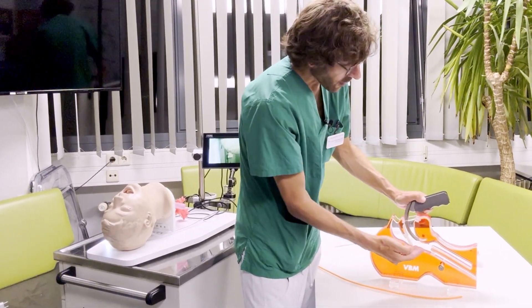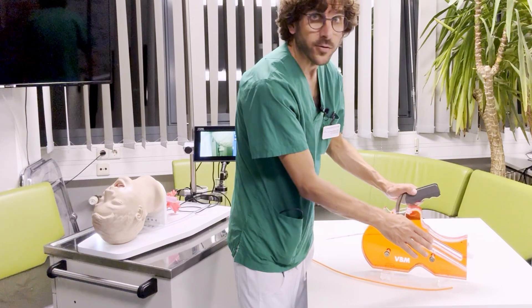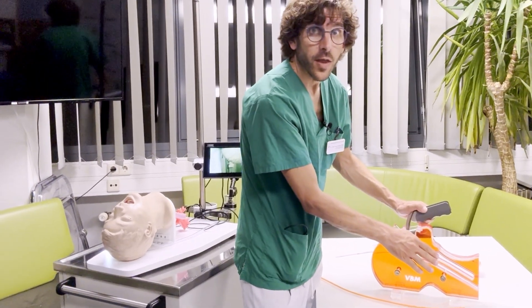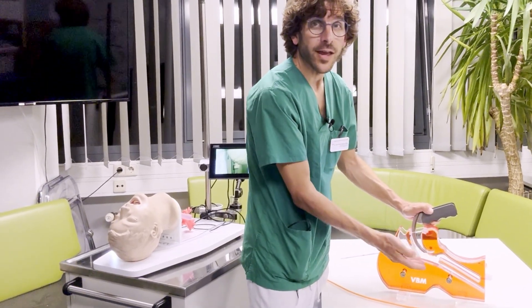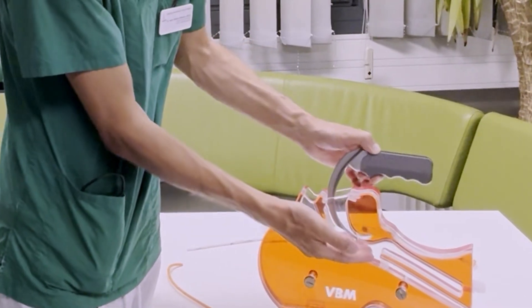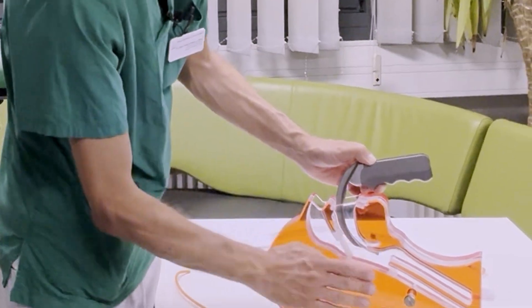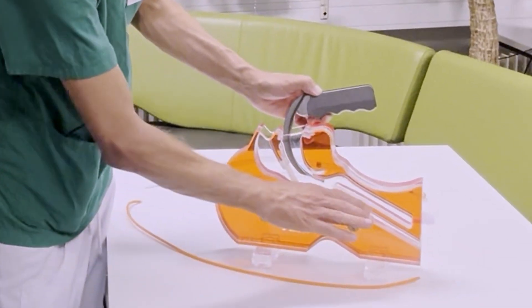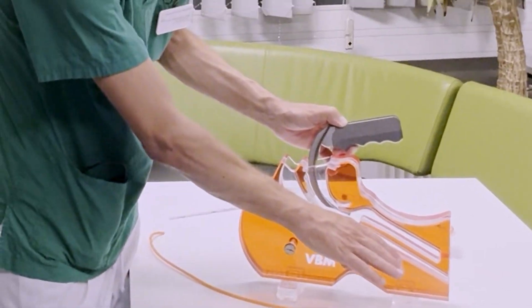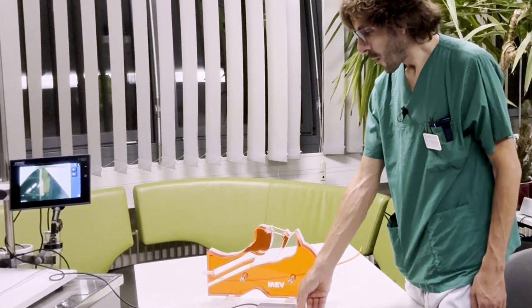So in order to smoothly go into the trachea, we have to navigate the second curve. The first curve is around the tongue; the second curve is in the opposite direction, down into the trachea.